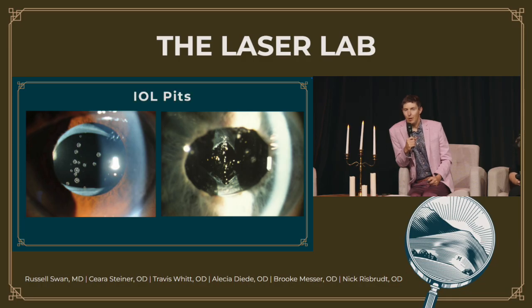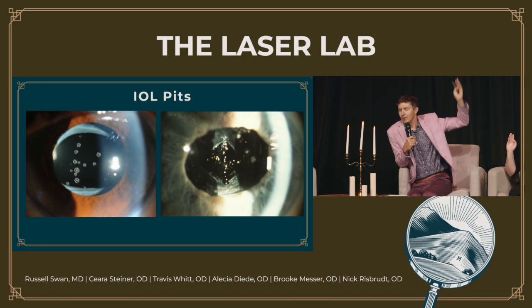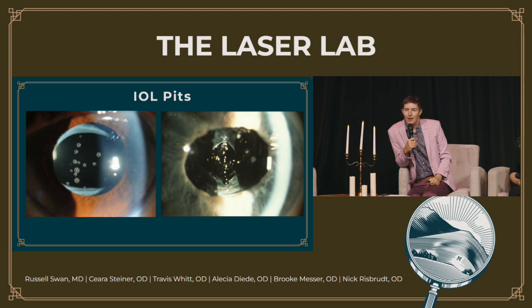So IOL pits, I'm curious, show of hands, how many people have seen IOL pits on an IOL? Yep. You will definitely see them in your career. So the right picture is a great example of somebody who had this beautiful cruciate pattern YAG capsulotomy, and they just went straight vertical, and then they went straight horizontal, and they pitted kind of all the way through that. And then the left one, a little bit more variable.